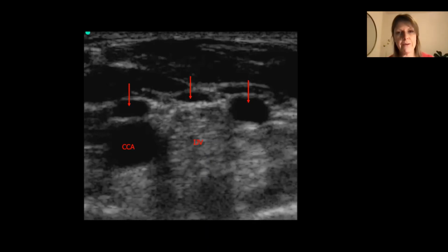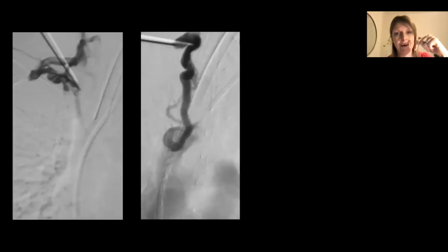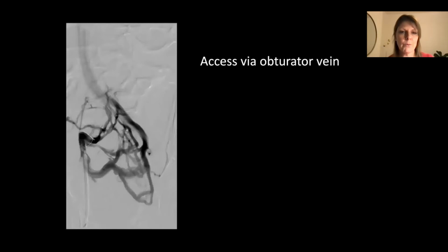And you can see with the arrows there, lots of very small little collateral veins trying to carry that venous return through other channels. In this patient, we've punctured a collateral in the right side of the neck. The contrast has gone north rather than south, so we've punctured again higher up, and you can see that tortuous collateral there, but we've managed to get a guide wire all the way through that collateral, followed with a dilator, followed with the catheter, and placed a Hickman line through it, as you can see here. Nice and easy.